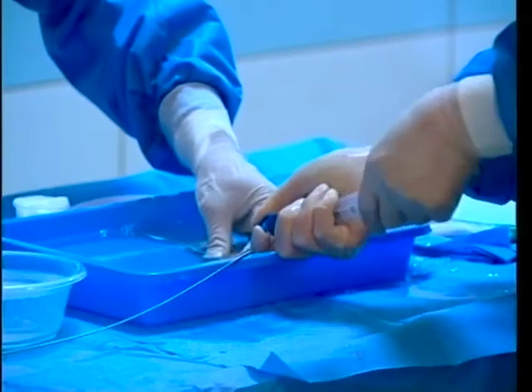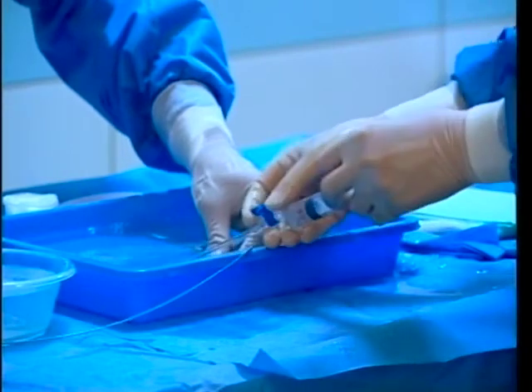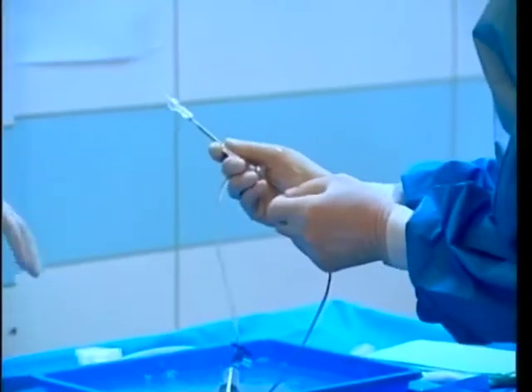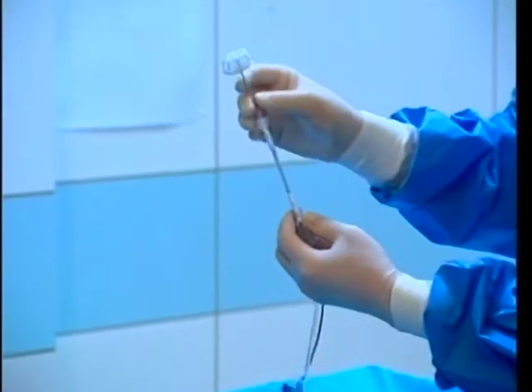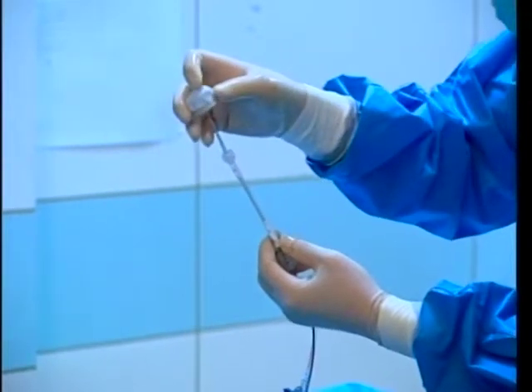Before you finish loading, could you show us the device? I think most of us are not so familiar with this one. Please push it out again. He has already loaded it, but we didn't see it. Please show the device. And also show us the different hooks which are there. I think that's important.